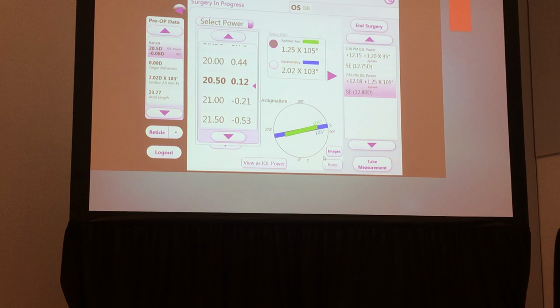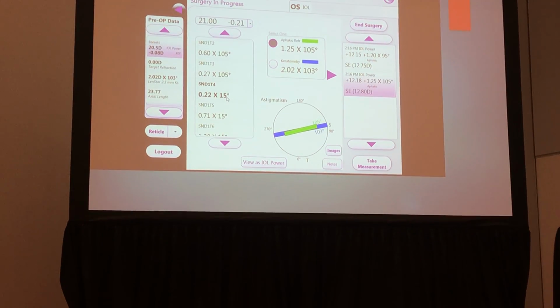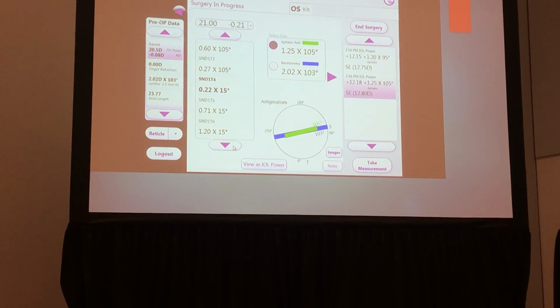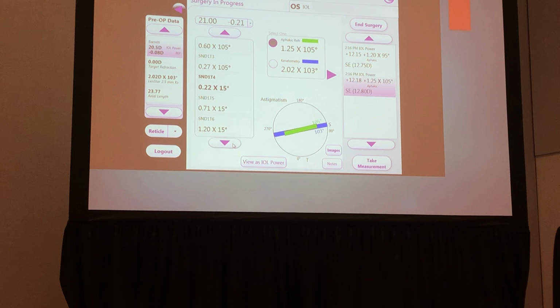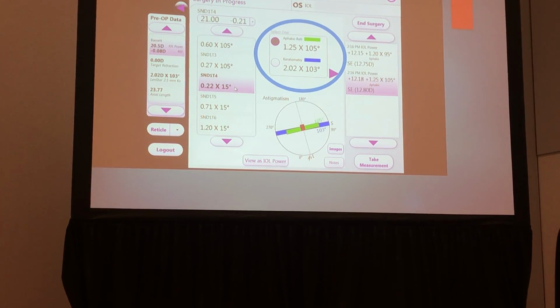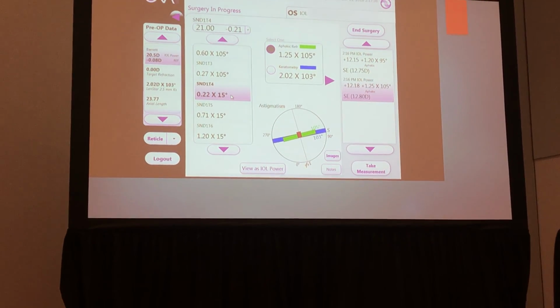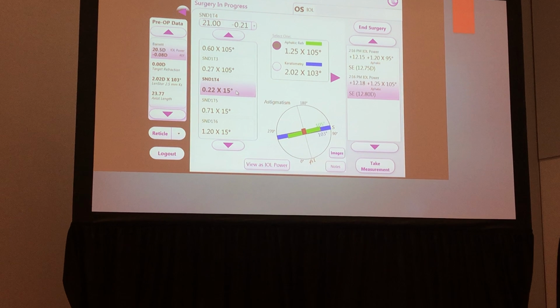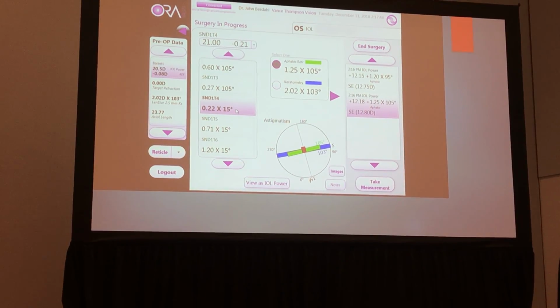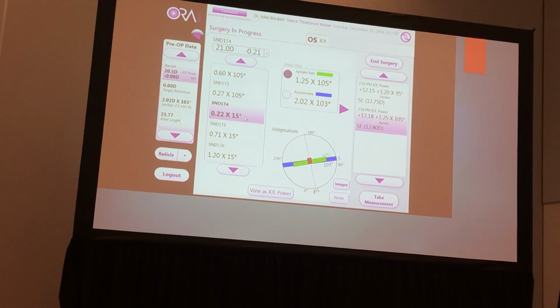And so we'll go ahead and do a change to a 21.0 diopter lens, and I'm going to go ahead and go with the T4 that was recommended. So isn't it interesting that the keratometry measurements called for 2 diopters? We read 1.25, and it's still a T4 lens. The reason for that is because aberrometry is taking into account the measured posterior corneal curvature, where the Barrett lens is estimating what the posterior corneal curvature would be, and in this case, they're similar.